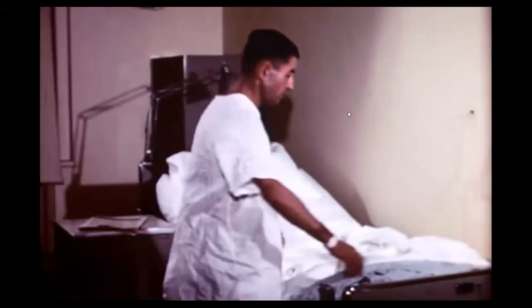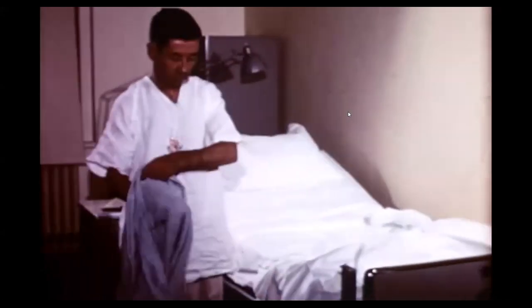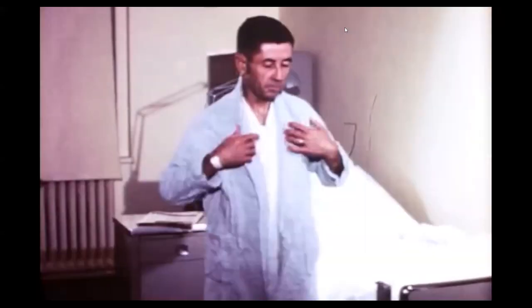You will note that this patient's heart rate remains rather constant even when he is moving about. This stems from the fact that the patient also wears an implanted electronic pacemaker, which keeps the beat uniform under ordinary conditions. But if an emergency arises, signals will be observed in the monitoring room and this patient will receive immediate help.